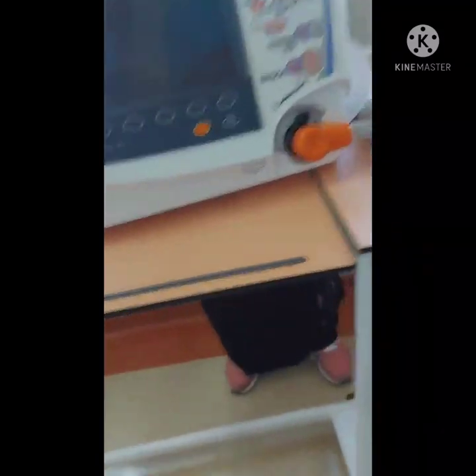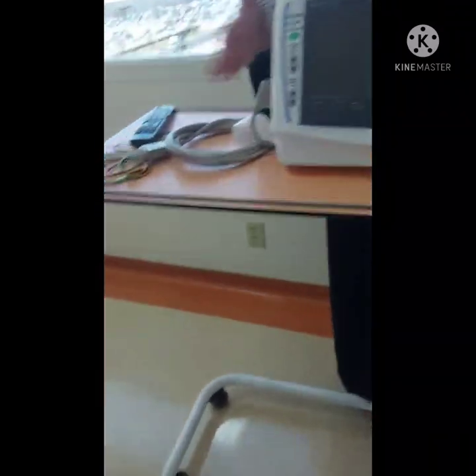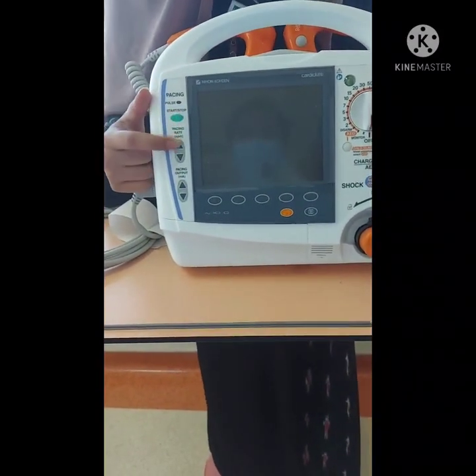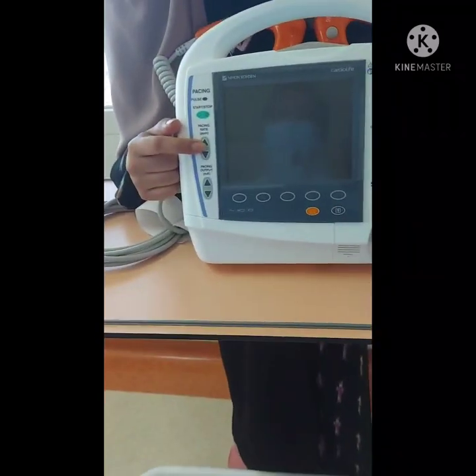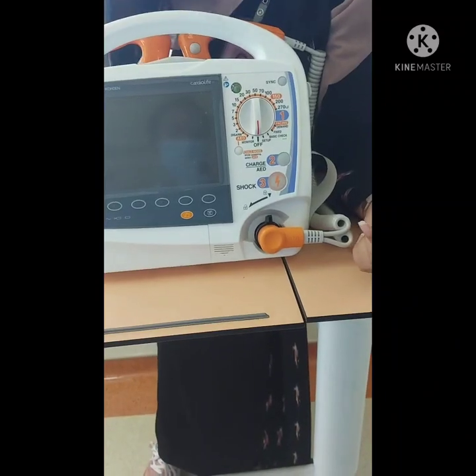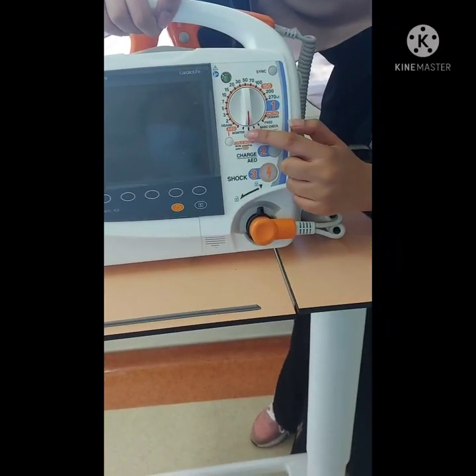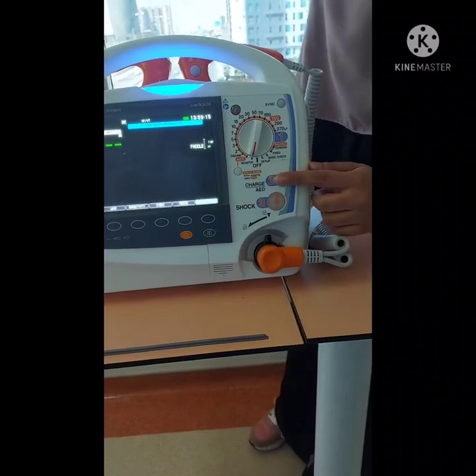Okay, so this is everything from the outside. You can see here it's for the pacing. All this is for the pacing. So you just turn it on and off, and you change the milliampere and also the pacing rate. For here, if we want to turn on the defibrillator as the monitor, you can see its monitor here. Just go to that.